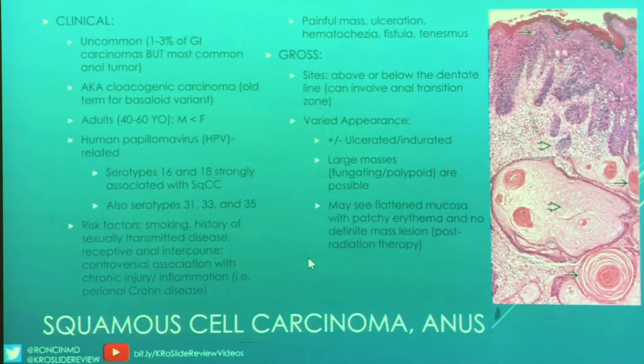I suppose there would even be an argument about ulcerative colitis, but I think where they were trying to go with this was more the fistula formation and fissures that just keep getting irritated and opened up. But again, that is highly debatable. HPV is the thing to know for this, HPV.